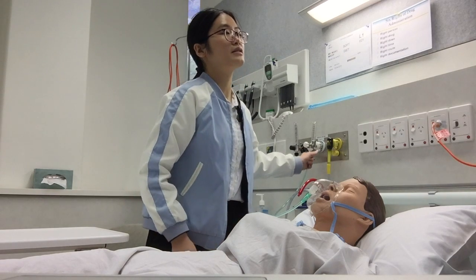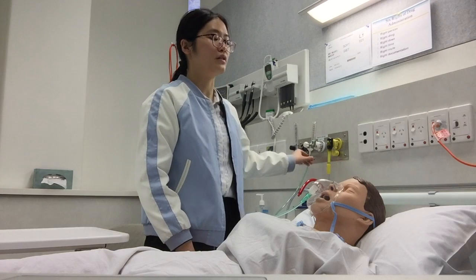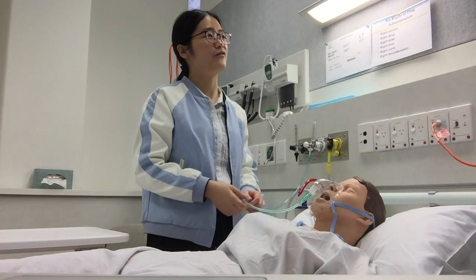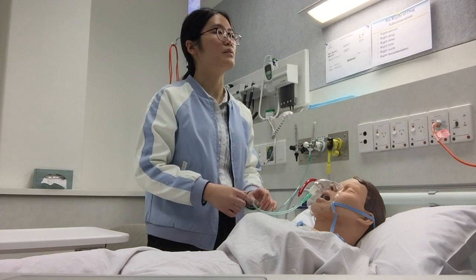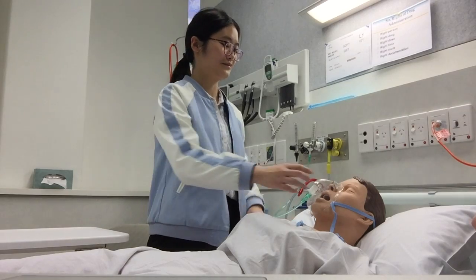Usually for masks, we deliver higher than 5 liters, because if you deliver lower than 5 liters, there will not be enough oxygen to flush the carbon dioxide out of the mask, and the patient will breathe in too much carbon dioxide. Yeah, understand. That's good.